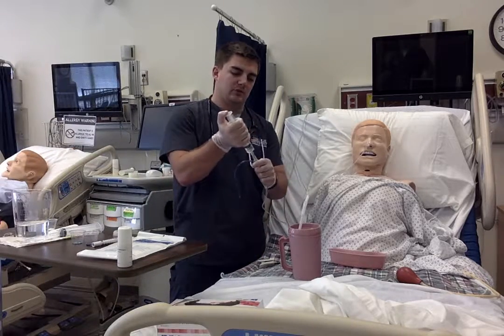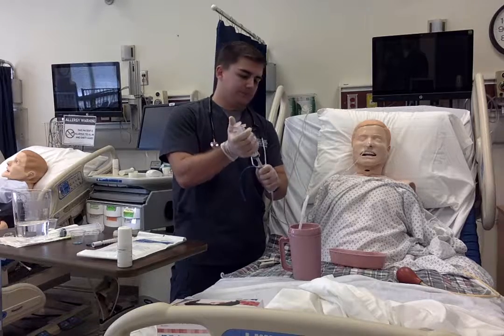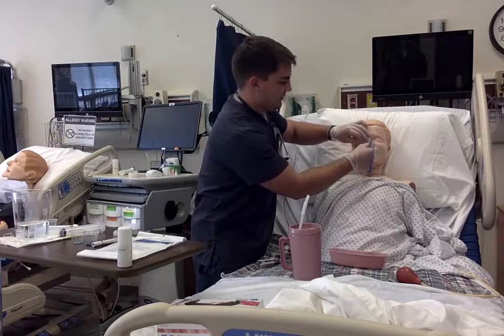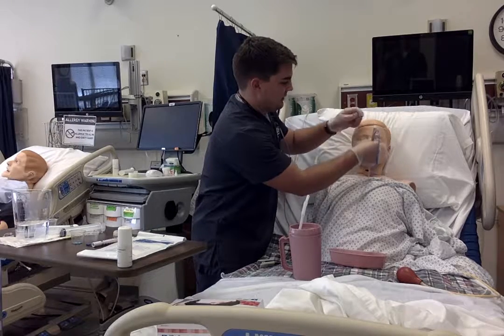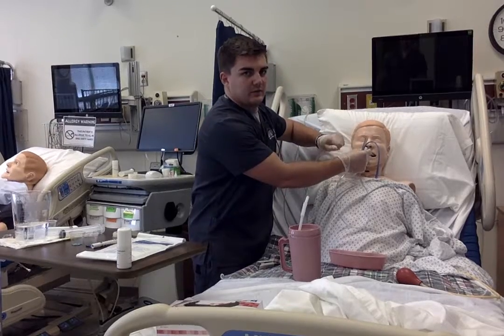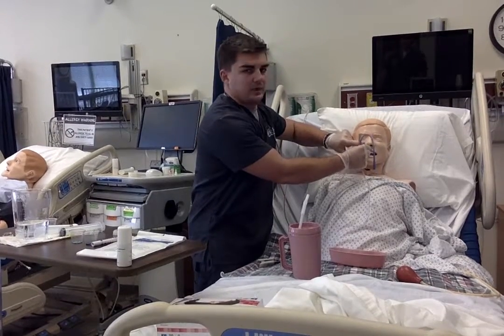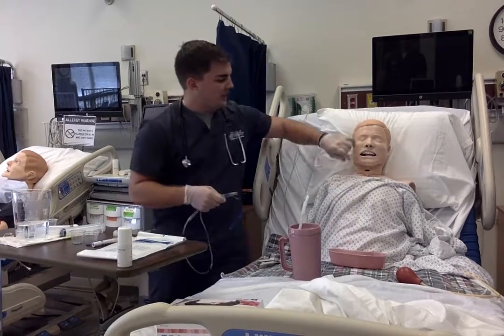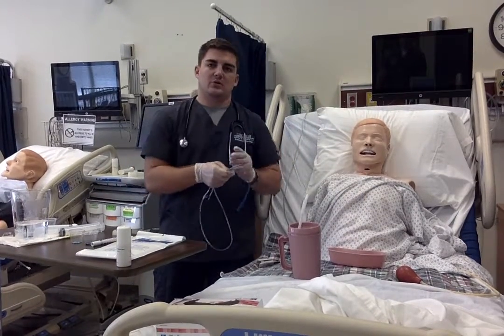So I instill the water, and then I can remove the tape. I tell the patient to take a deep breath and remove the tube smoothly and quickly so there's no irritation. Then I can wipe away any leakage or drainage on the patient's nose and document the procedure.